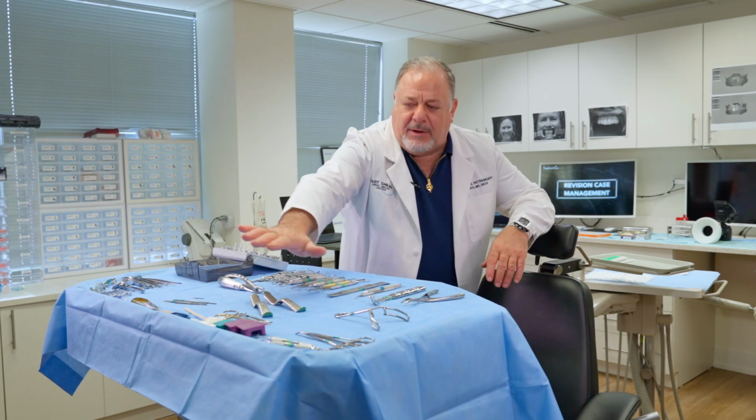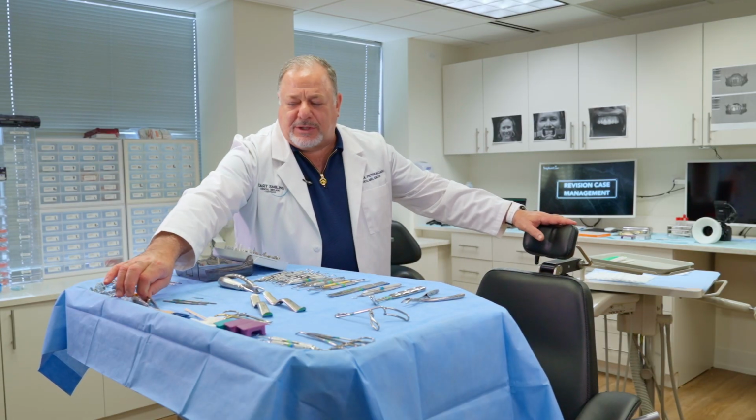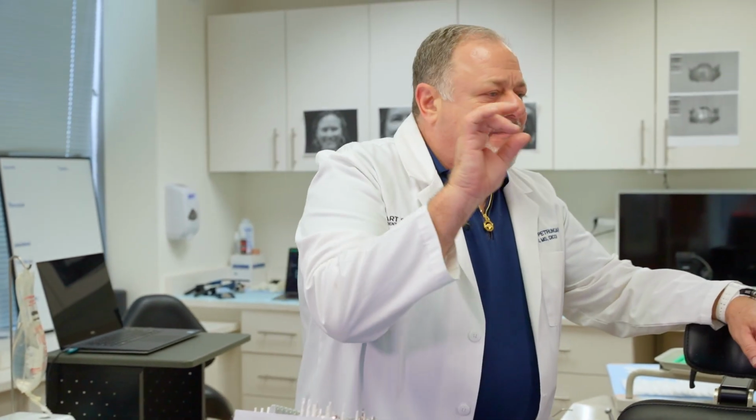And then we have our bite blocks, our suturing material, our Castro Viejos and sutures, which again, in all cases we do, I suture with Castros. To me, they're much more specific for fine suturing, but also the heavier Castros are just as good for suturing for all on X's and much more heavy duty type suturing material.